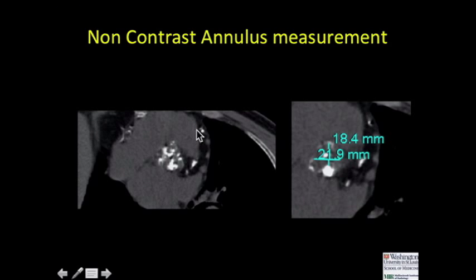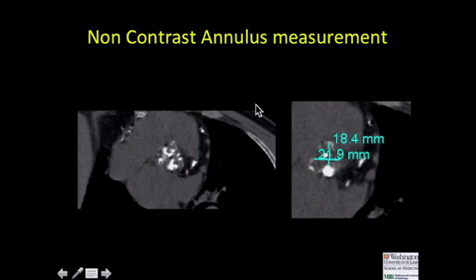On non-contrast studies, we also get a very nice look at the degree of calcification of the annulus and aortic valve, which is important for our cardiology colleagues. Through the annulus itself, we measure anterior to posterior and medial to lateral as best we can.